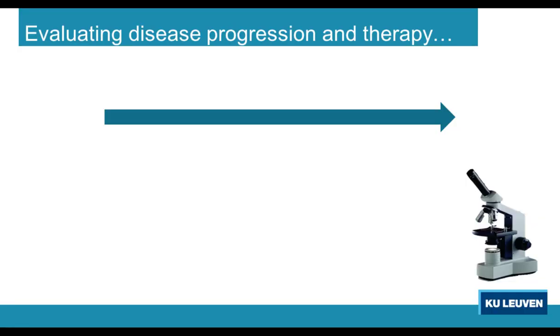So let me start by illustrating a bit what the motivation behind non-invasive imaging is in general. In many of the preclinical research setups, we want to evaluate a disease model and possibly also therapy, and these are all dynamic processes. So things change and progress over time. So that's our time course.